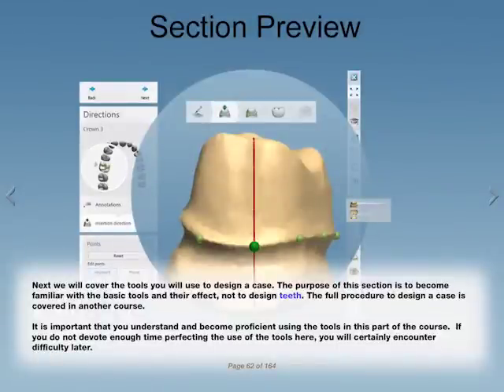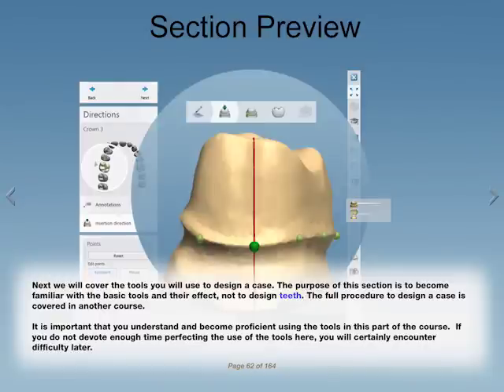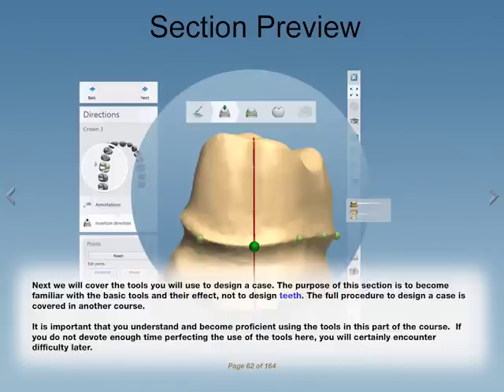Next, we will cover the tools you will use to design a case. The purpose of this section is to become familiar with the basic tools and their effect, not to design teeth. The full procedure to design a case is covered in another course. It is important that you understand and become proficient using the tools in this part of the course. If you do not devote enough time perfecting the use of the tools here, you will certainly encounter difficulty later.